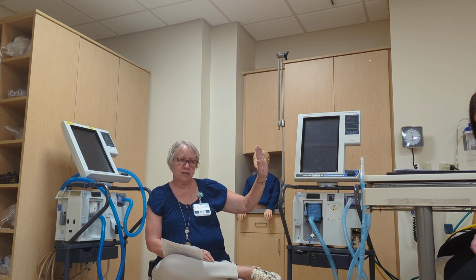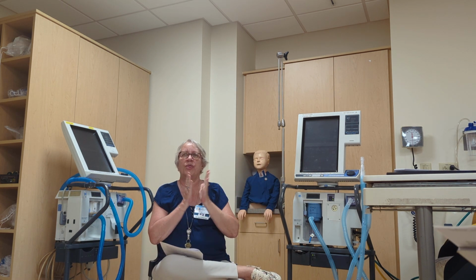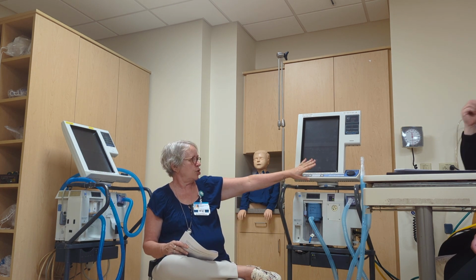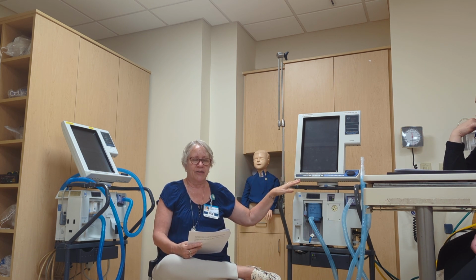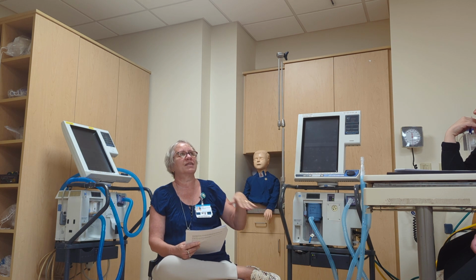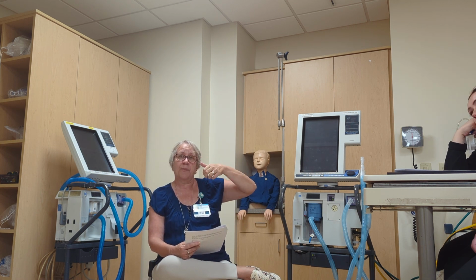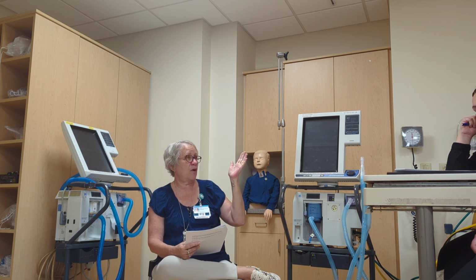You set it as low as you can because we want to see the numbers, okay? So I'm going to set it to 200, and we're going to try this. Then I'm going to find these limits on these ventilators and set them as high as I can, because then I'm going to plug up that patient port to see what kind of number I get, all right?